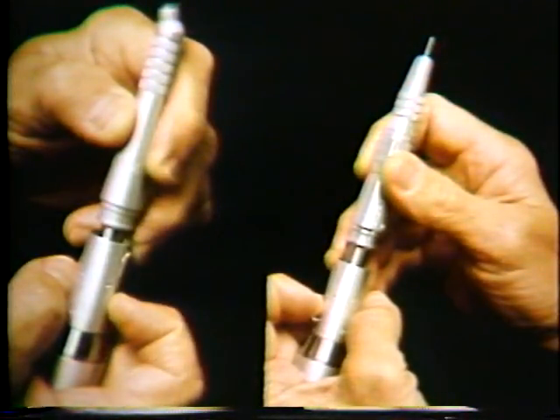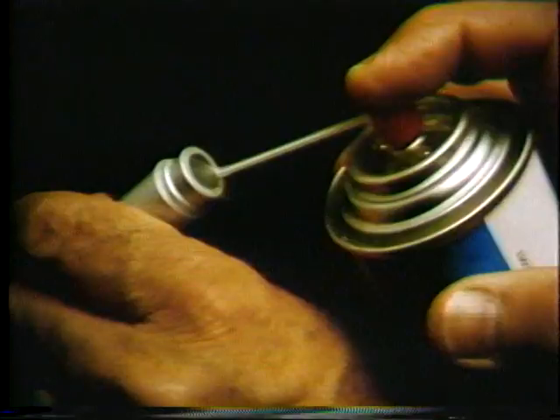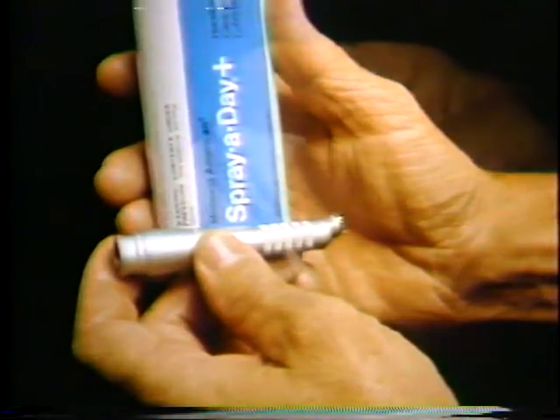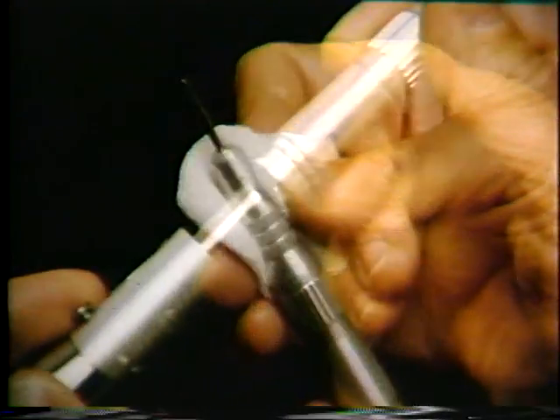The straight and angle attachments should be removed from the motor and cleaned every day that it's used, and then sprayed with spray-a-day. It should be sprayed into the back end of the straight attachment and into both ends of the angle attachment. After inserting a burr, place the attachment back on the motor and run it to discharge excess lubricant.